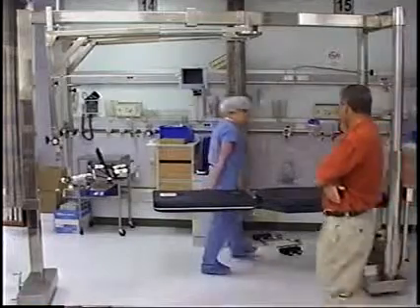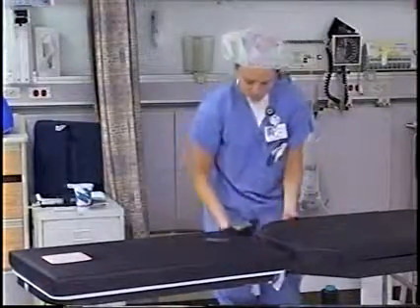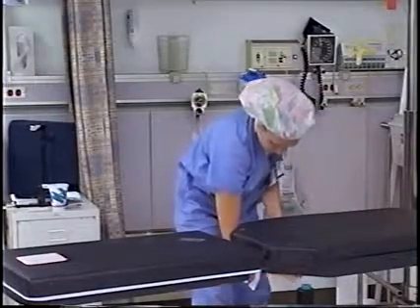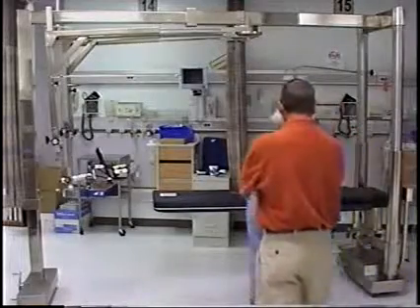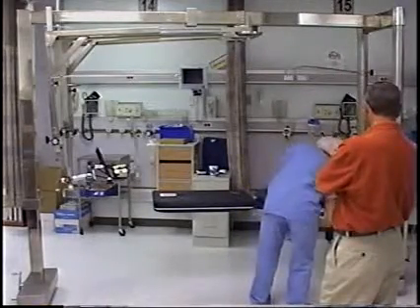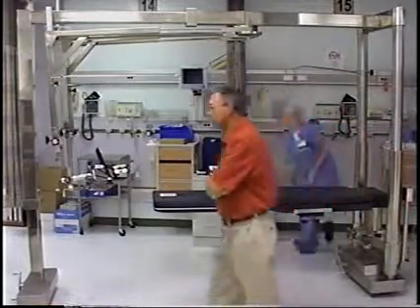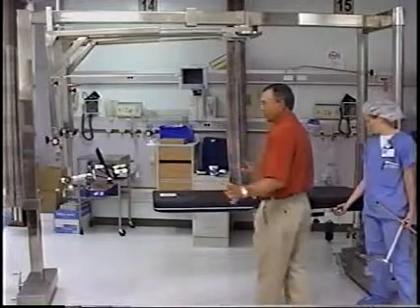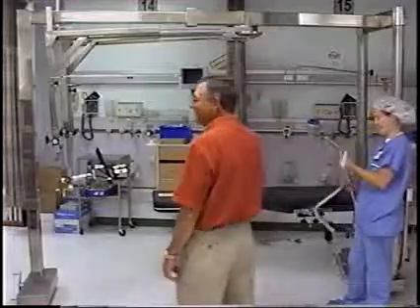Okay. Doing good. Upside down. There you go. On those removable side rails, the knobs go underneath. Oh, yeah, these are standard. The U.S. side rail is 1 1/8 inches in width, and anybody's side rails will fit on those. Skytron, ours, Steris. Anybody's side rail will fit on that.